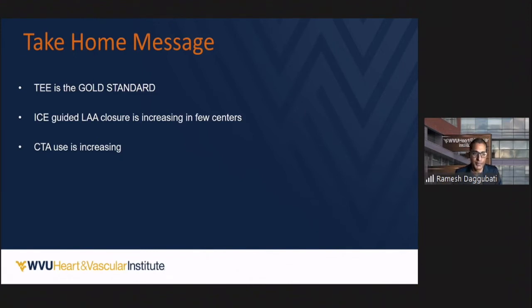Thank you very much, Dr. Ramesh, for a wonderful talk and beautiful explanation of the ICE imaging. You have shown that it is possible to do. For long, people thought ICE was very good for septal puncture, but unless you enter the LA, the imaging is not good enough. Most people thought CT is a must if you're using ICE in the beginning, and you may have to do some angiographic views because you're still not fully confident of what ICE can show, but you showed it very well, Dr. Ramesh. Yeah, I recommend CT for ICE actually. If you're going to do ICE, you should do CT.